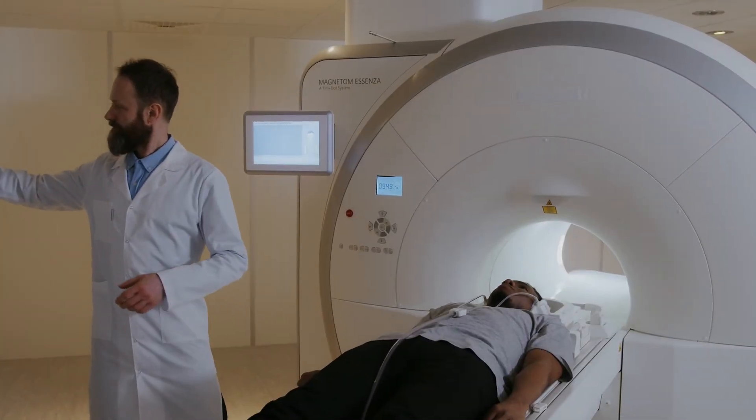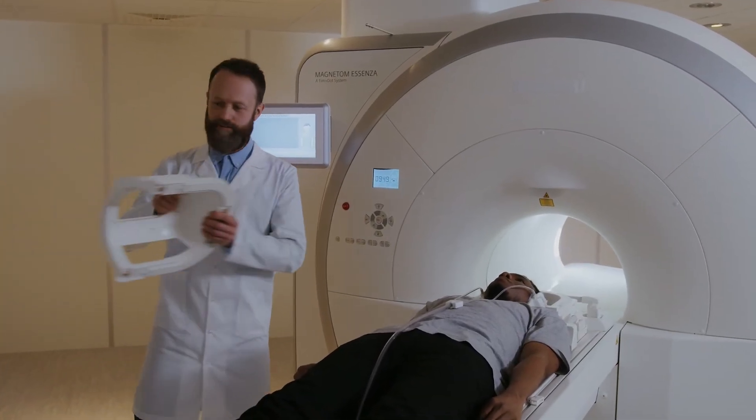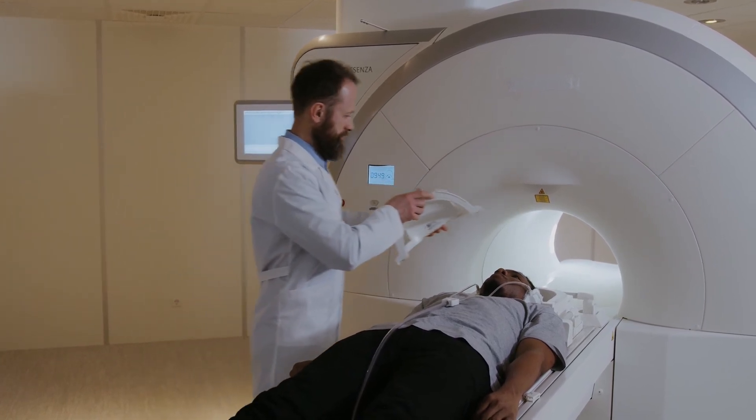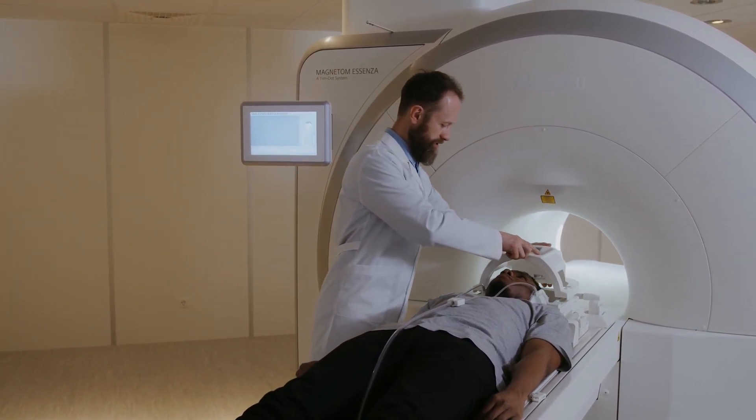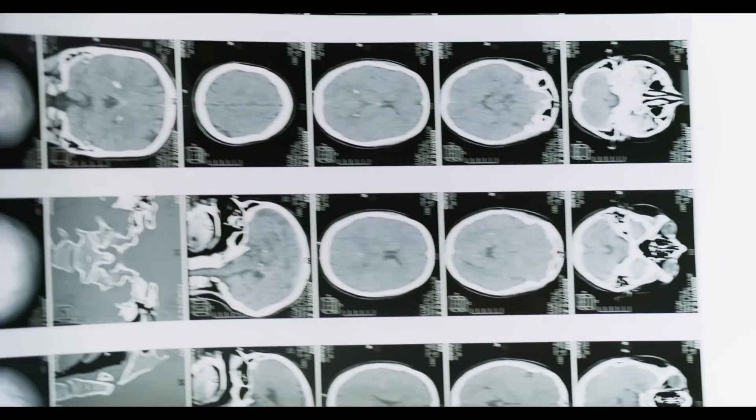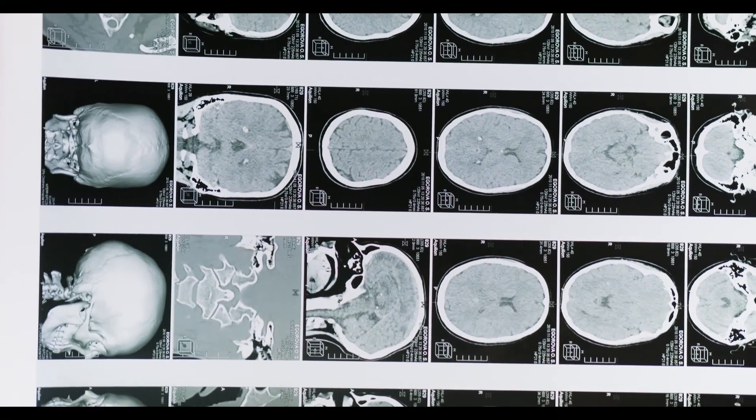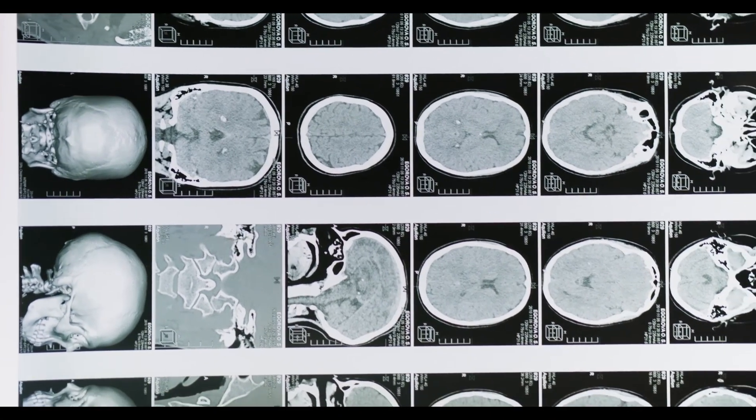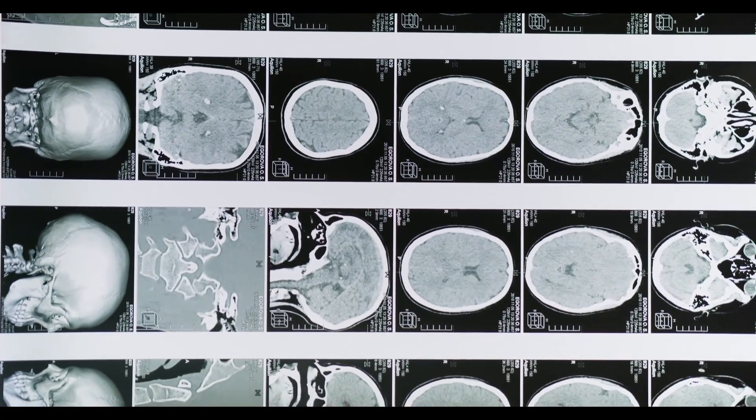Now, either T1 or T2-weighted images can be valuable for different purposes, such as investigating different neurological disorders. Also, T1 and T2-weighted images are just two of the many scans that can be done. And there are a lot more parameters that can be tweaked to get different kinds of structural MRI images.